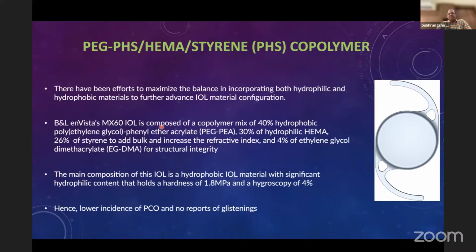So the main composition of this IOL is a hydrophobic IOL material with significant hydrophilic content that holds a hardness of about 1.8 megapascals and a hygroscopy of 4%, and they have a lower incidence of, very few reports of glistenings.